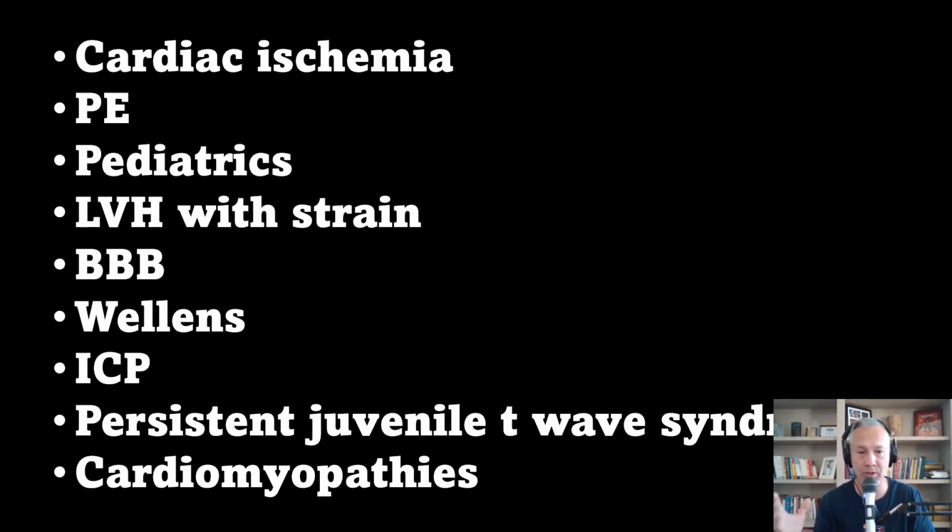So the history that you would get is a patient that was having chest pain and is no longer having chest pain. You get a 12-lead ECG and you see inverted T waves in V1, V2, V3, and sometimes V4. This is not a good sign. These patients need to go to the cath lab. They have a very high percentage of re-occluding the vessel. So when you hear that history, I was having chest pain, I'm not anymore, and you see these inverted T waves, go. And I'm going to show illustrations of all these ECG findings here in a moment.